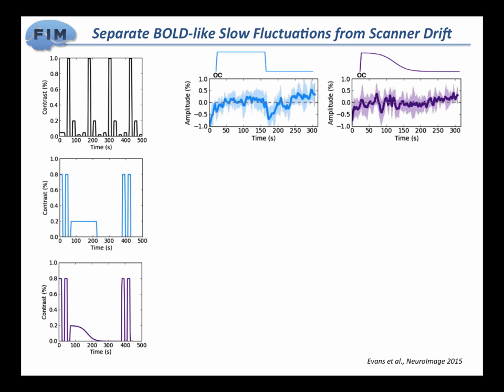For example, in AFNI you decide the order of a set of Legendre polynomials, and we might be removing things of interest. If you're doing pharmacological studies where the fluctuations that you're hoping to get are these really, really slow ones, then it's really hard. And here MEICA can be one of the places where it can be very helpful.